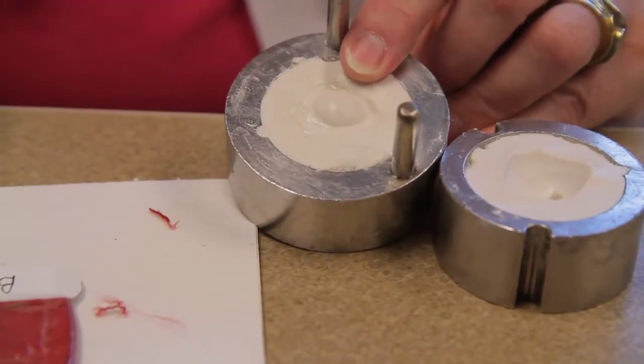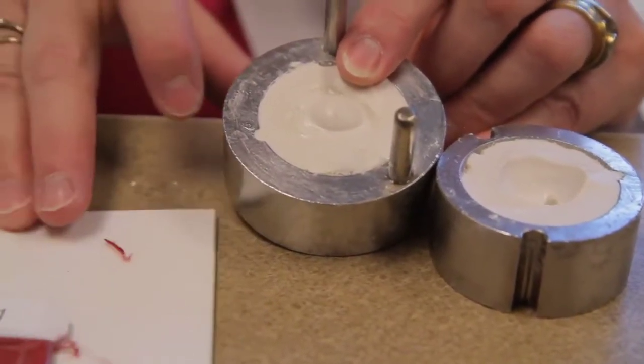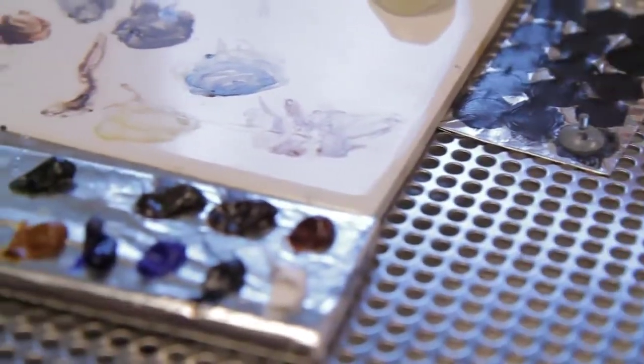I go ahead and place my color in there. I will then put methyl methacrylate acrylic, which is a medical grade acrylic, made in a dough state. I put it in the model, squeeze it down under pressure, and put it in the machine to cure it.